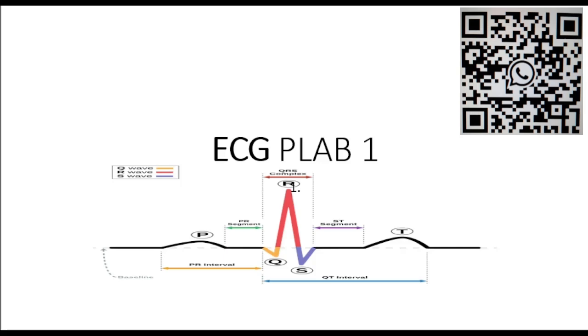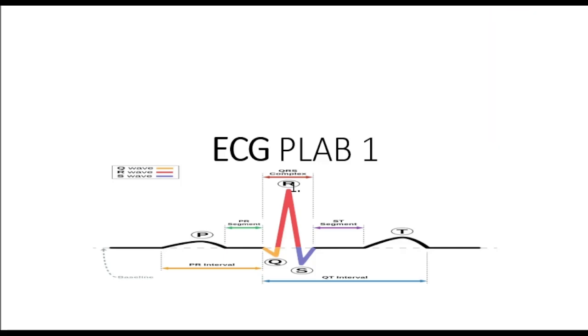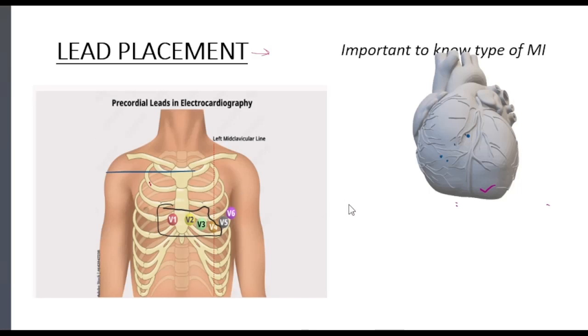Hello everyone, we will start our cardiology lecture with lead placement. Lead placement is important to know because to find out the type of MI we are dealing with, we should know the lead placement. If you know this, it would be easy. You don't have to memorize it.